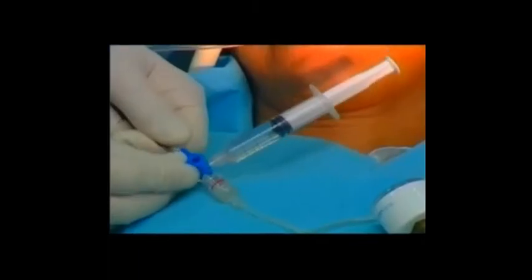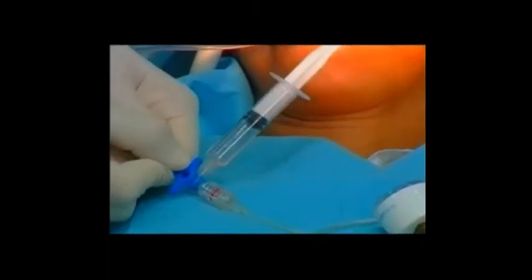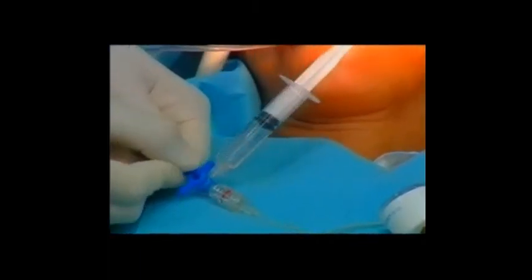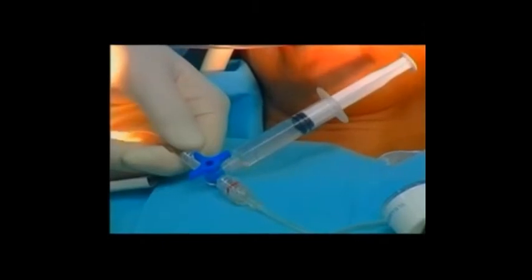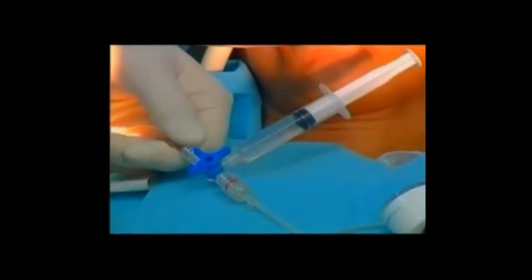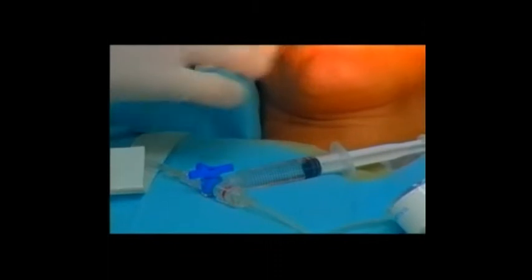After five minutes, the handle of the three-way stopcock is turned towards the 5cc syringe, and the contrast fluid emerges from the balloon into the syringe, and the balloon harboring device is removed.